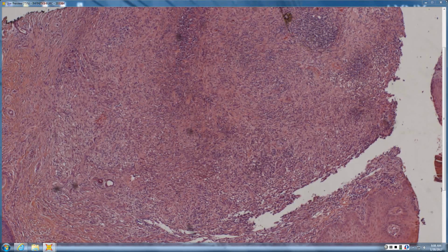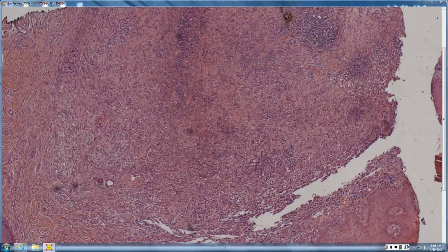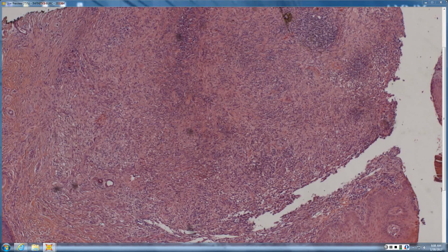And this was something with a lymphangitic spread up the arm. So it would be more of your sporotrichoid differential. Sporotrichoid, which would include sporotrichosis and mycobacteria like marinum, the atypical mycobacteria. So several of those from the list. Yeah. And then don't forget nocardia on that, especially in the south.